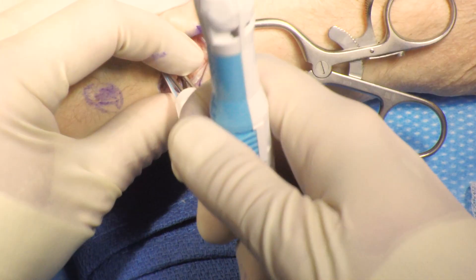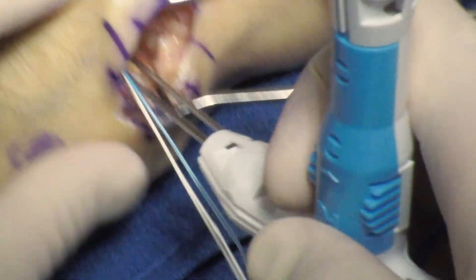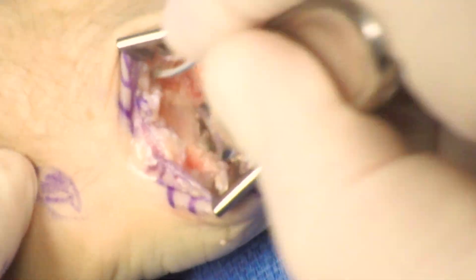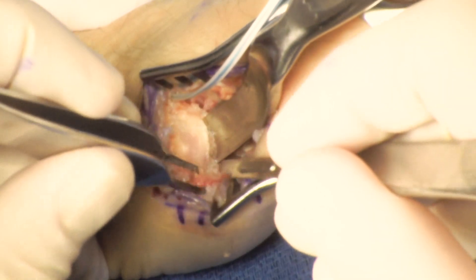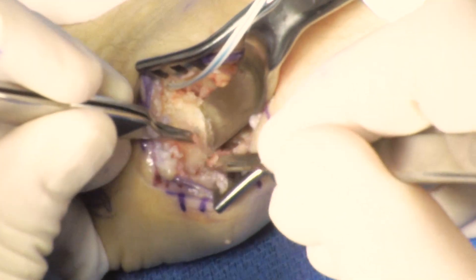Gentle traction is placed on the inserter to confirm anchor seating. The cover is removed, sutures are removed, and the inserter is removed. Traction is then placed on the sutures to seat the anchor, and the guide pin is removed. I got this trick from my partner Andrew Greenberg, who uses a McGlamrey elevator to elevate the base of the first metacarpal to aid in anchor insertion.